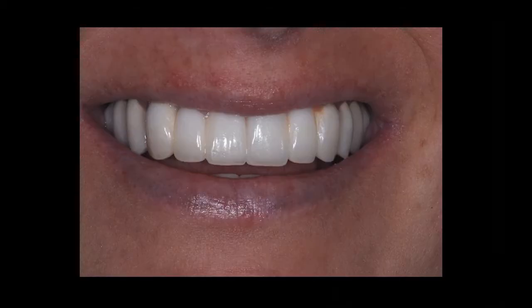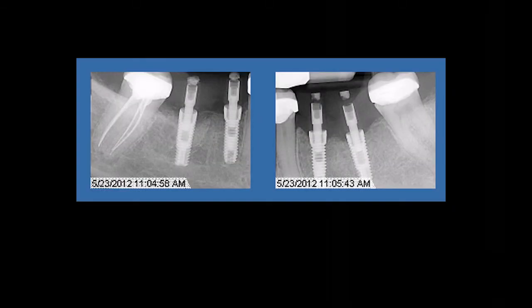These are the final restorations here. Just a nice, good patient, nice result. Came back and then did individual implants on the bottom so we could get rid of those fixed bridges. And that was pretty much it. So guided surgery, you know, I don't know. I'm on the fence about using it blindly.